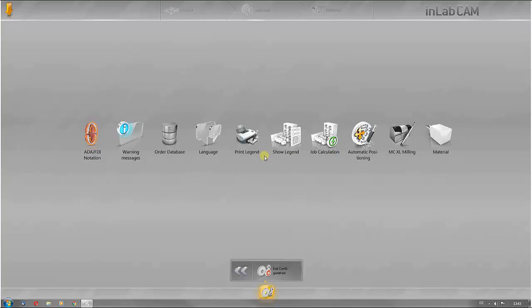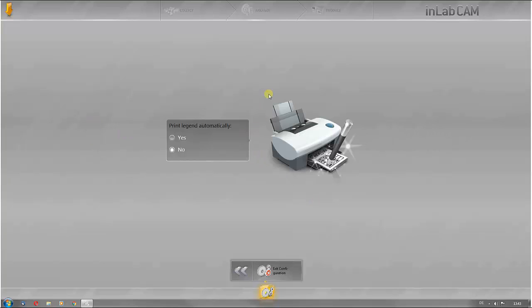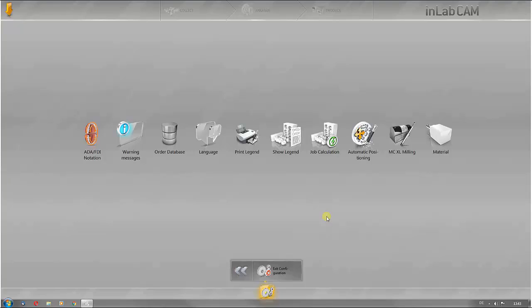You can also set the legends to be printed automatically. Click on this symbol to set the software language.